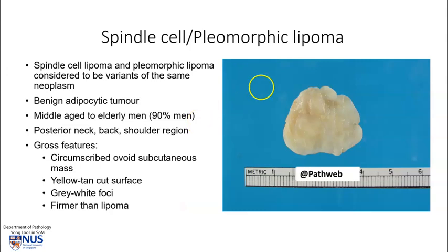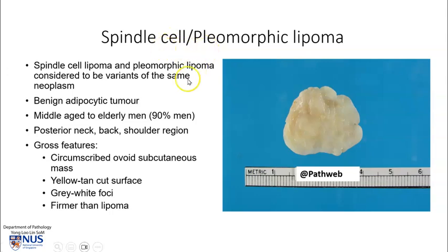There are several other types of lipomas in addition to the classical lipoma, and here is an example of a spindle cell or pleomorphic lipoma. These two lesions are generally considered to be variants of the same neoplasm, so we can see mixed spindle cell areas and also pleomorphic areas in the same lesion. This is also a benign adipocytic tumour, and interestingly, this tends to occur very specifically in middle-aged to elderly men, and usually in the region of the posterior neck, the back, and the shoulder region.